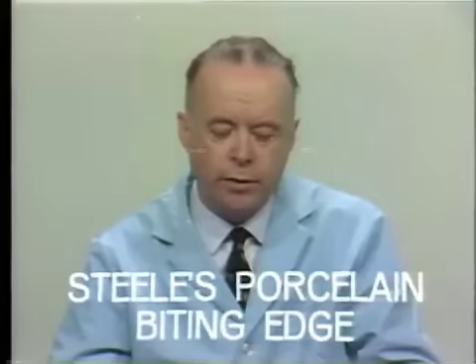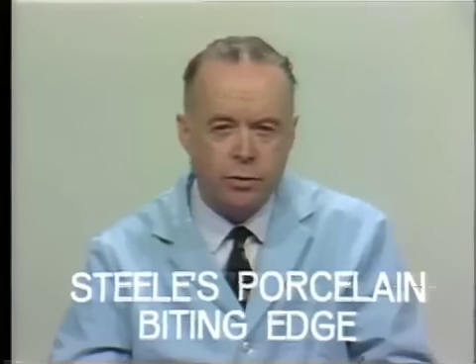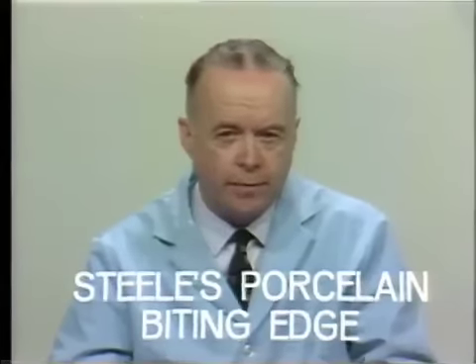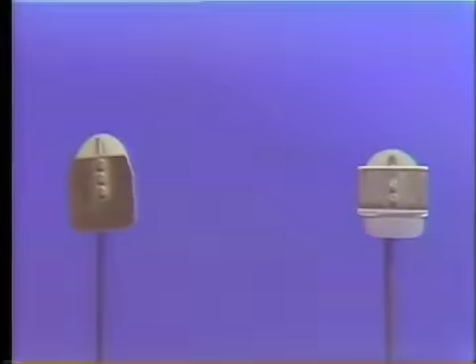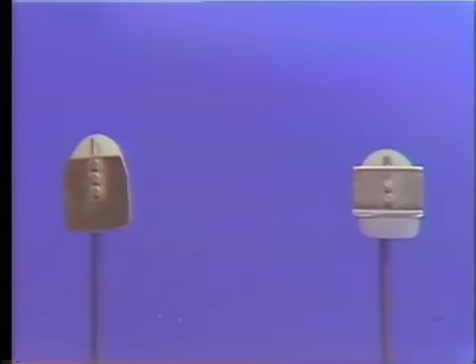The Steele's porcelain biting edge pontic, although not extensively used, is a useful modification of the Steele's flatback in cases where a translucent incisal edge is required. And I have here on the table two examples, one of the porcelain biting edge, which you see on the right-hand side of the screen, compared with the porcelain flatback, which we've been talking about on the left-hand side of the screen.